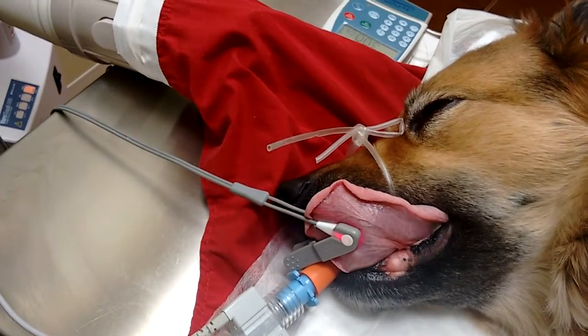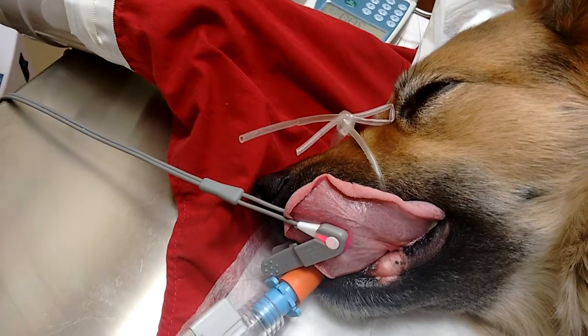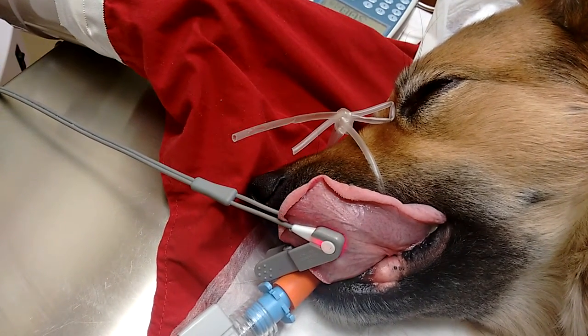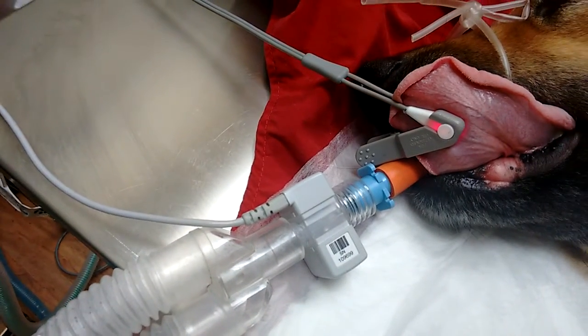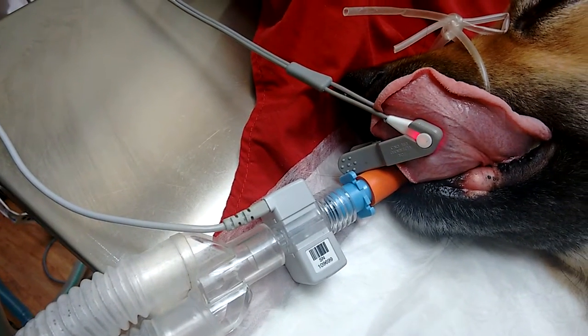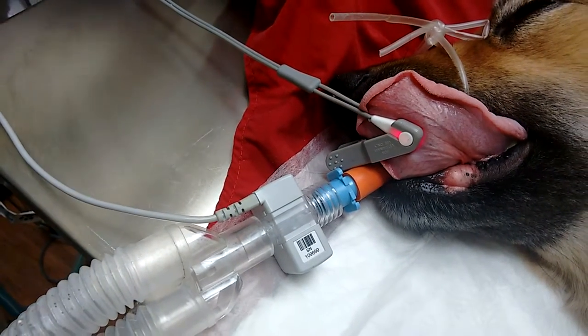This is the pulse oximeter connected with the tongue to measure oxygen saturation in the pulse. This part, connected with the gas and the endotracheal tube, is the capnograph, used to measure CO2.